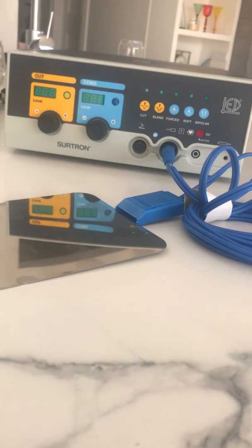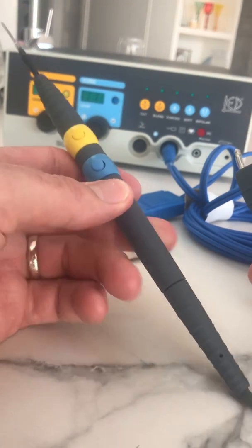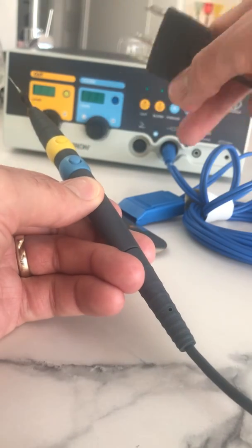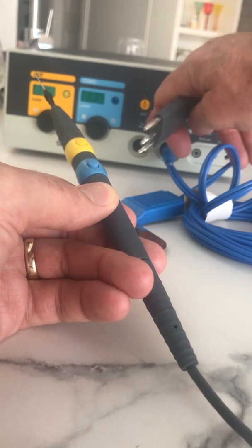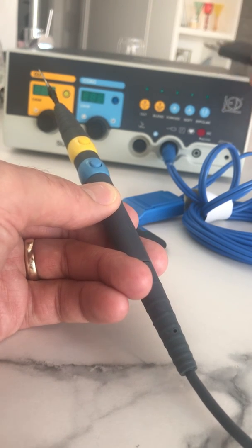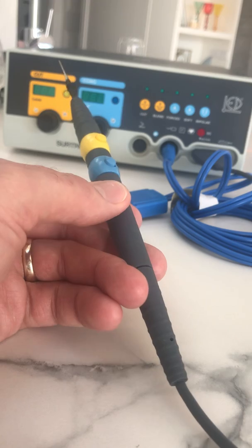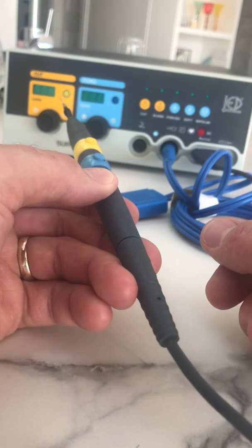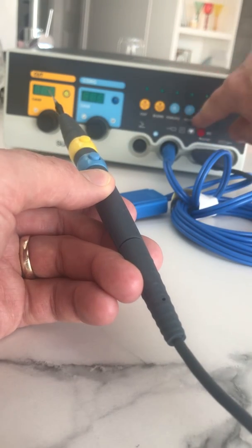Now we're going to get the pencil itself — this is the monopolar one. With a bipolar-able unit and a monopolar handle, the switches are available as well. The yellow switch will trigger the yellow or cut mode, of which you've got two: cut and blend — blend being a little bit of cut and a little bit of coag at the same time. This plugs in only one way, into the three-pin socket like that. The hand switches will select and trigger the respective channel — blue or yellow — whichever one you've chosen from the face panel.